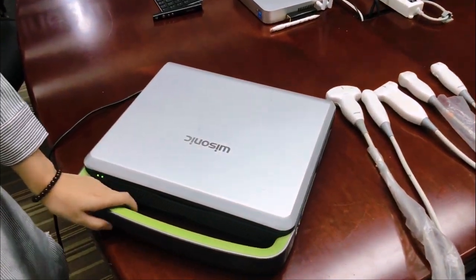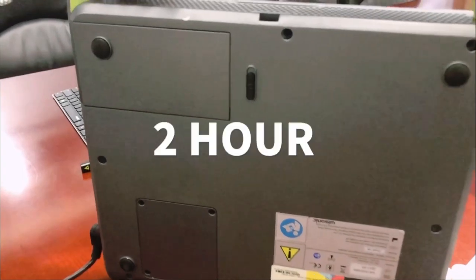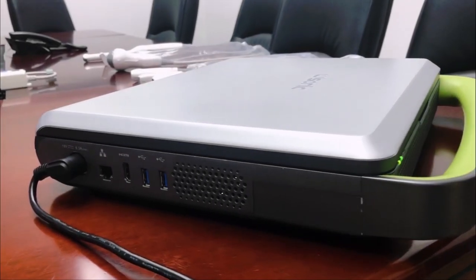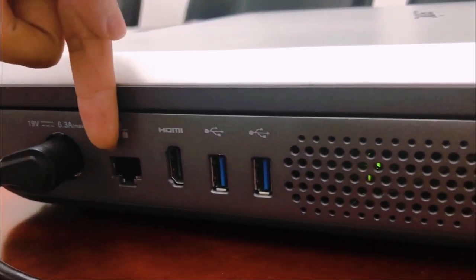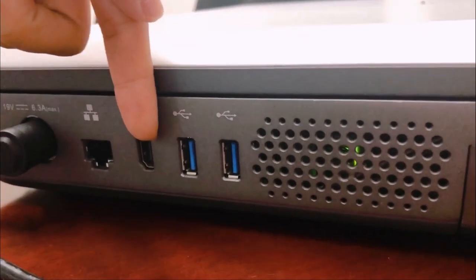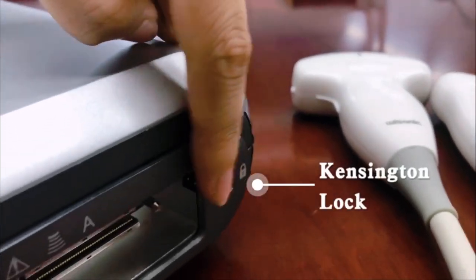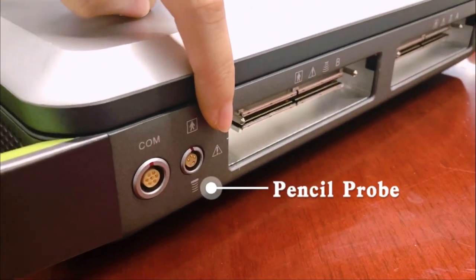There is one lithium battery inside. After fully charged, it can last 2 hours for real-time scanning. On one side, there are connection ports for the power adapter, internet, HDMI, and 2 USB ports. On the other side, there are a Kensington lock, pencil probe port, and a port to connect the ECG module.